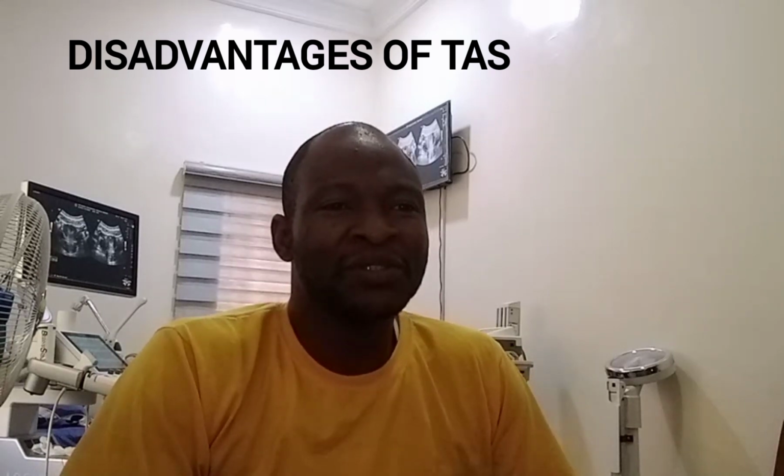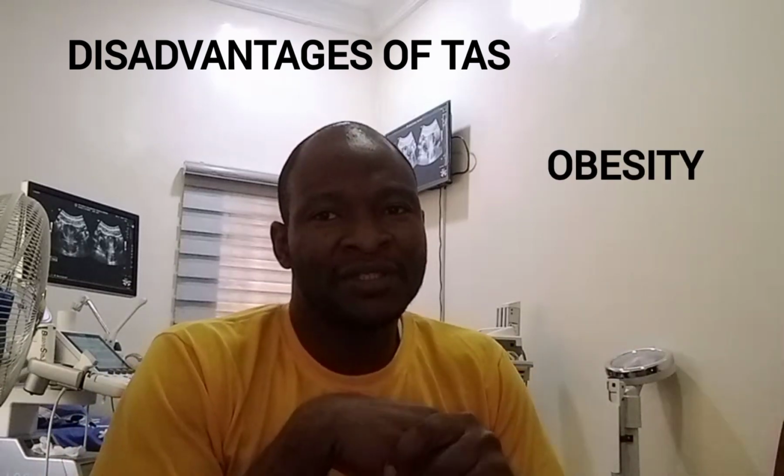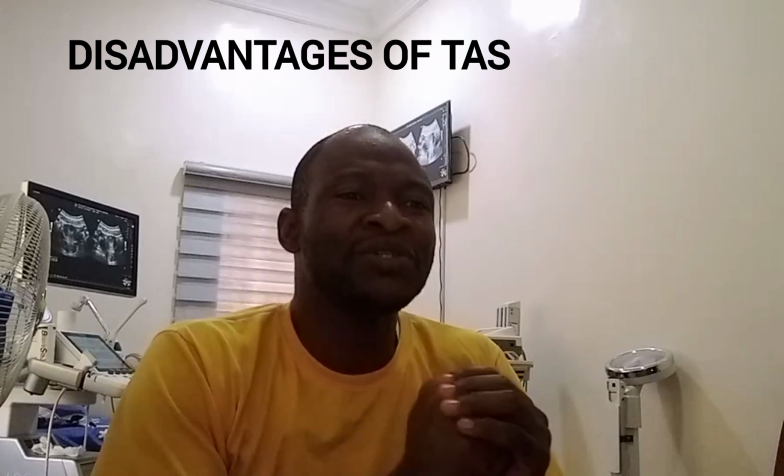There's also difficulty evaluating obese patients, which is the reason for the alternative TV scan. Recent surgery or scarring, barium or air-filled bowel will limit access.